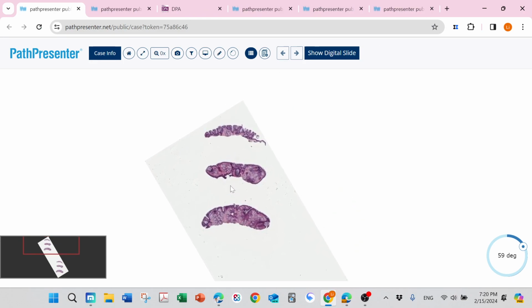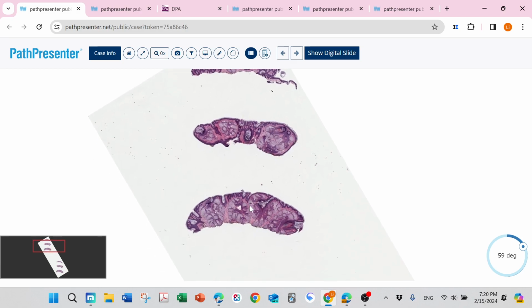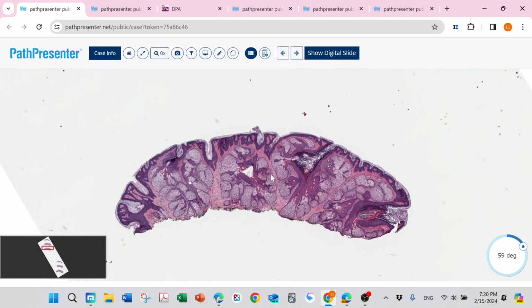Then here's another entity, even low power, which catches our eye, this bubbly cell. It seems just around the hair follicle, but we just have too many of this structure. This is sebaceous gland. So when we have more sebaceous gland than usual, we have our differential. This one is just sebaceous hyperplasia. Another one is sebaceous adenoma or maybe sebaceoma. How could we tell them apart?